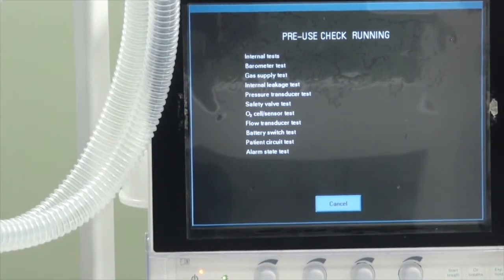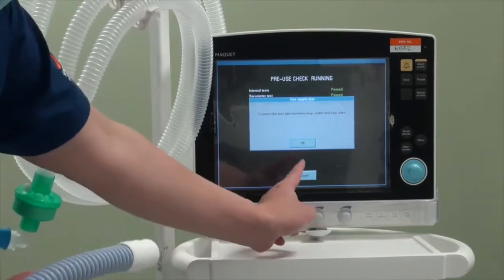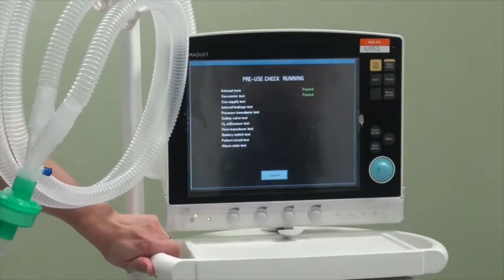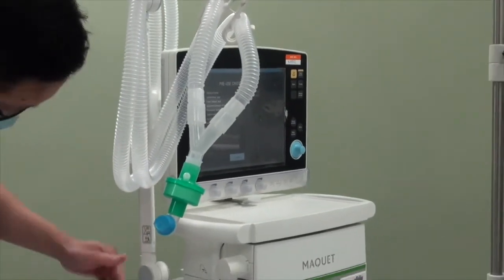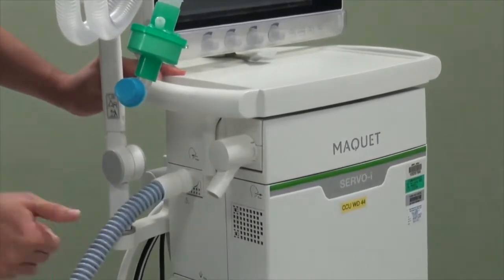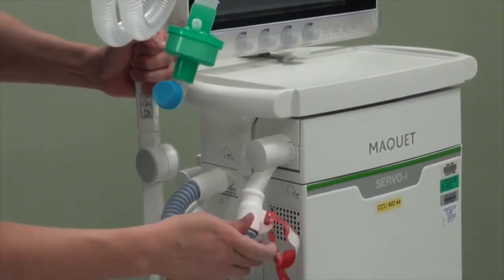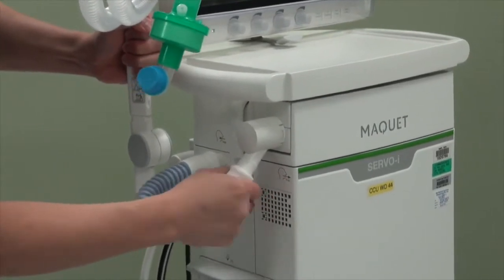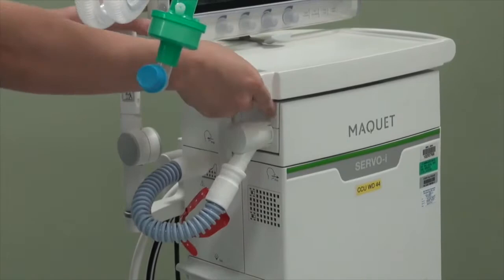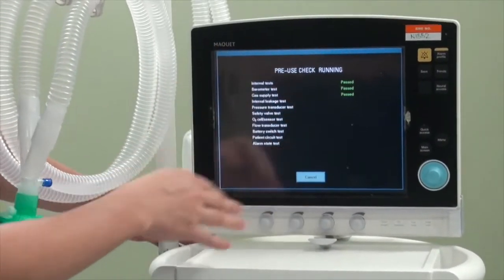Your ventilator should come with a gas tubing, which is used as part of the pre-use check. What you need to do is install the gas tubing into the inspiratory as well as the expiratory limb. Make sure that it is tightly screwed in. Once that is done, the ventilator will detect it.